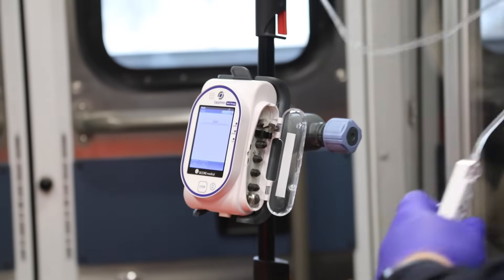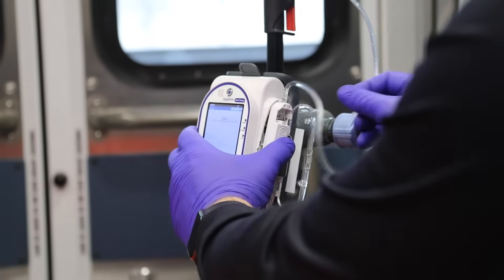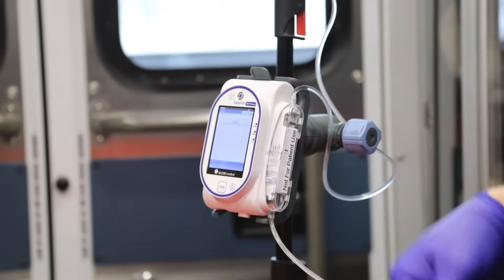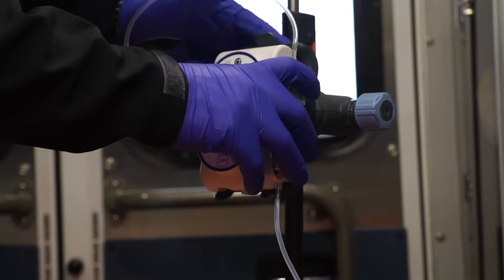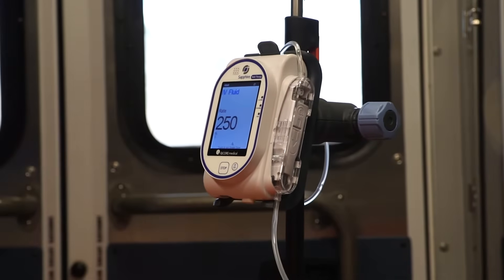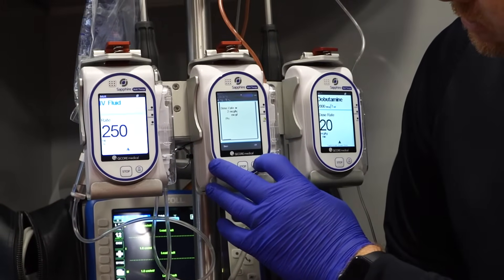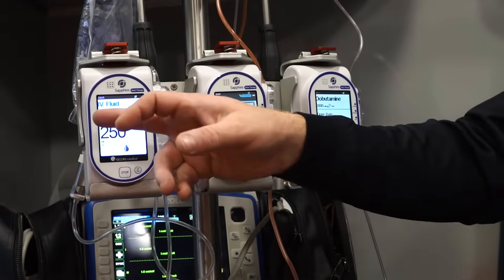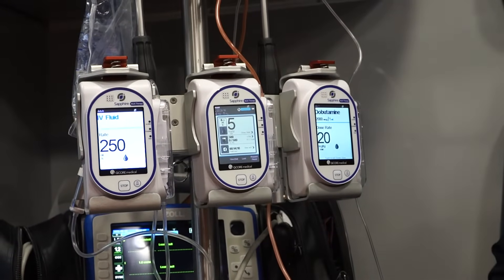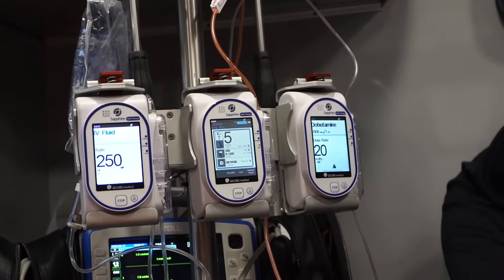They do have proprietary drip sets like most pumps — it's just a cartridge that snaps into the side. A lot of folks ask what if that door gets knocked off. Whatever infusion is running will not stop. However, you do have to have this door in place to start a new infusion. So if for some reason this door gets sheared off mid-infusion, you don't have to worry about your patient care at that time, but you will have to get it repaired or replaced prior to starting a new infusion.